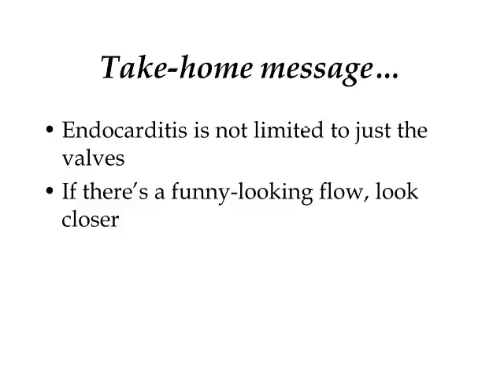In fact, we had another case here at Montefiore not too long ago where we had an aortic endocarditis that was complicated by a new ventricular septal defect. So when you see an abnormality, stop there and say, okay, I see it. Is there anything else crazy? And if there is, look closer. Things like this are sort of rare, which is why I thought it was important to share it with the audience, and I hope you found it as entertaining and as instructive as we did here at Montefiore.